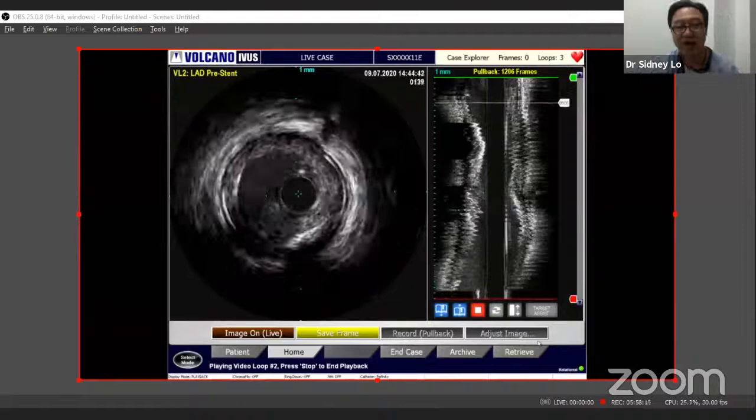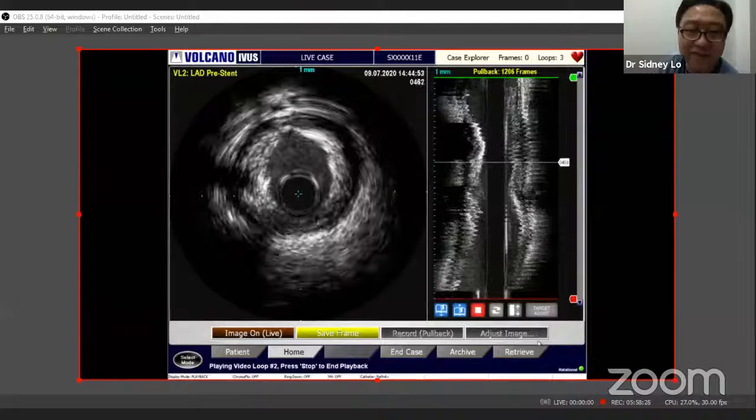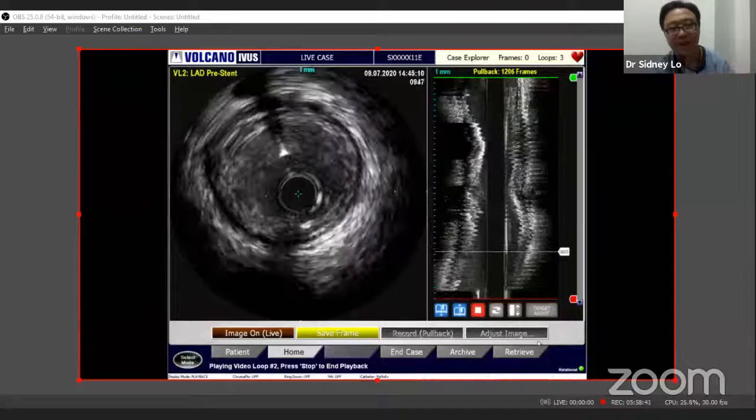So you see here, you can't get away with not stenting the LAD, and you can't get away with just stenting the ostium, because the plaque extension is very much throughout the whole thing all the way to the ostium of the left main. So there's also the other question about how much of the left main do you do? Is it okay to land in the middle if there's no disease? But the disease here is extensive. It goes all the way to the ostium. So you often will have to stent the left main across to the LAD. That's a great point, Sydney.